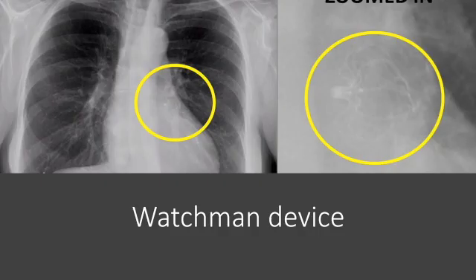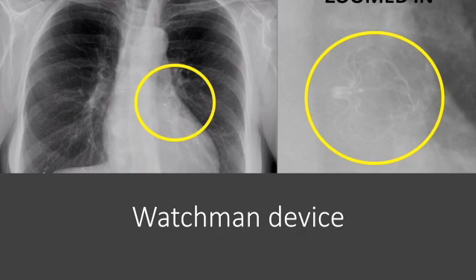These images show the left atrial appendage closure device, also called the Watchman device, which is an implantable device to close up the left atrial appendage for stroke prevention in patients who have atrial fibrillation and contraindications to pharmacological anticoagulation.